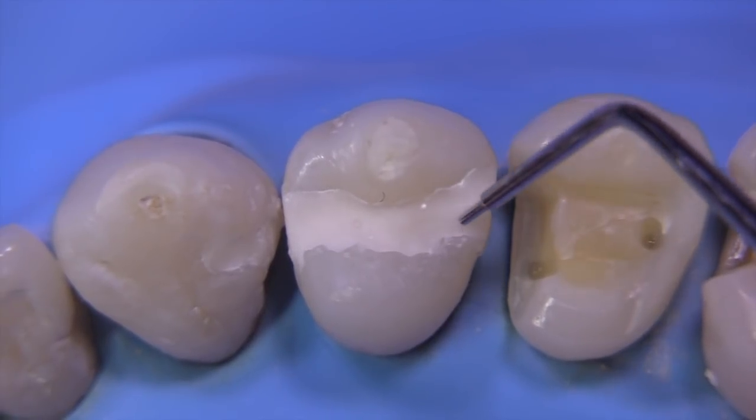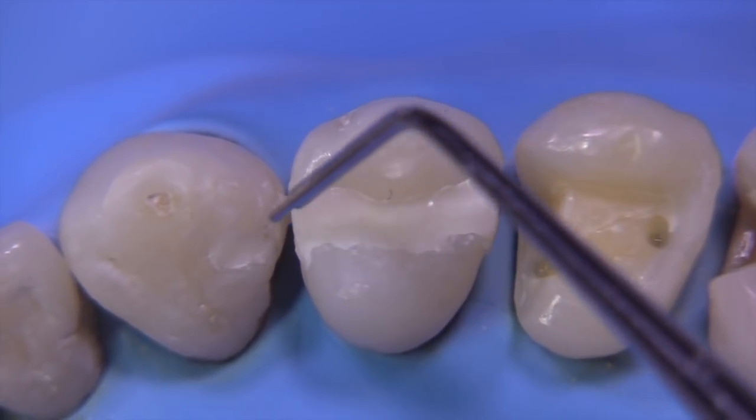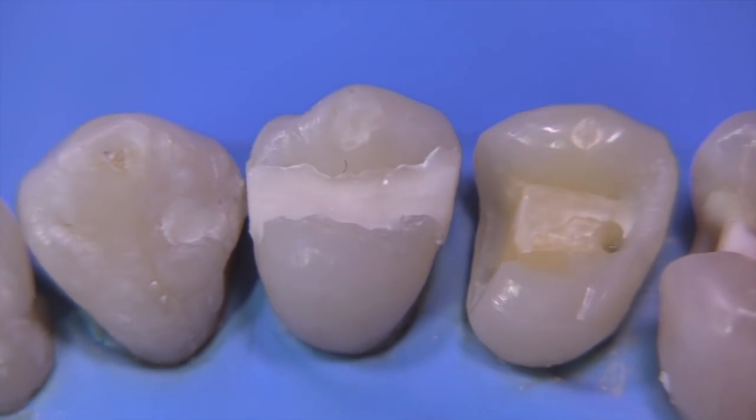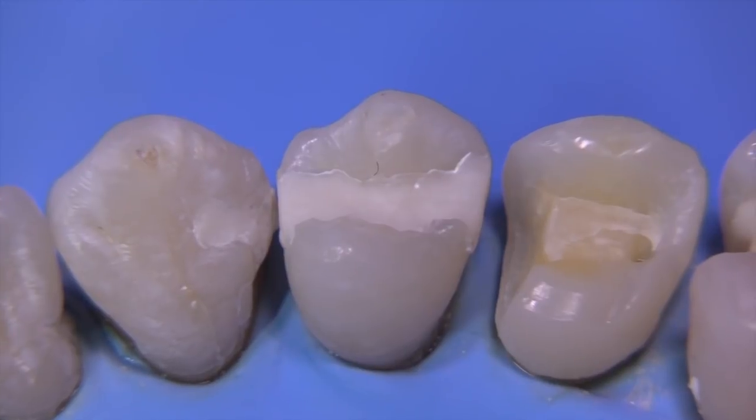Today we're going to be working on a hollow grind on the mesial and the distal of this MOD. And then in a future video, we're going to talk about the hollow grind on the distal of that canine.